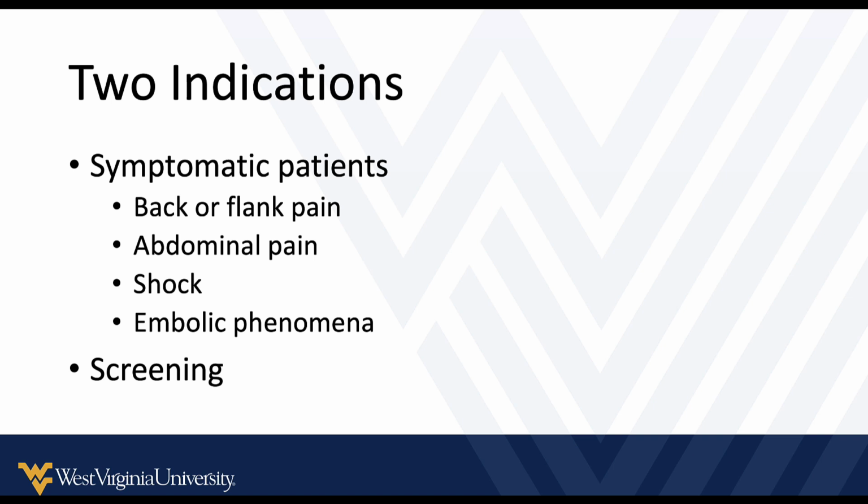The other one that we really want to target specifically today in the primary care setting would be in patients who qualify or should undergo screening for an abdominal aortic aneurysm, and we'll talk about those guidelines.